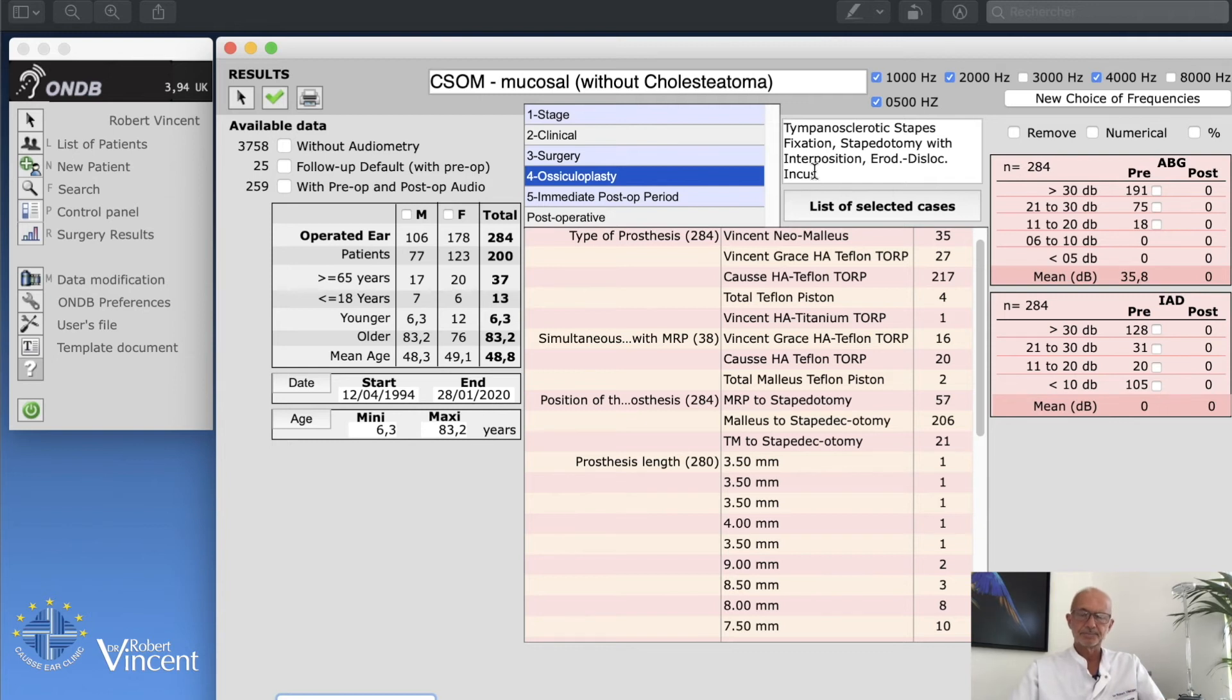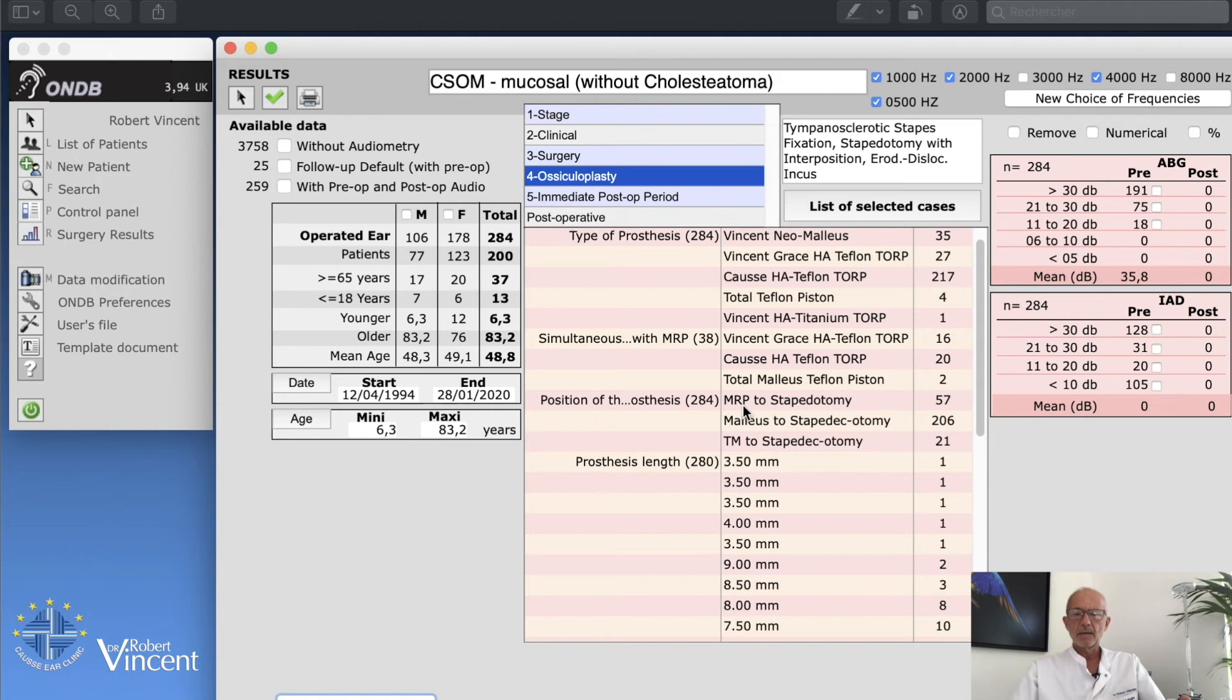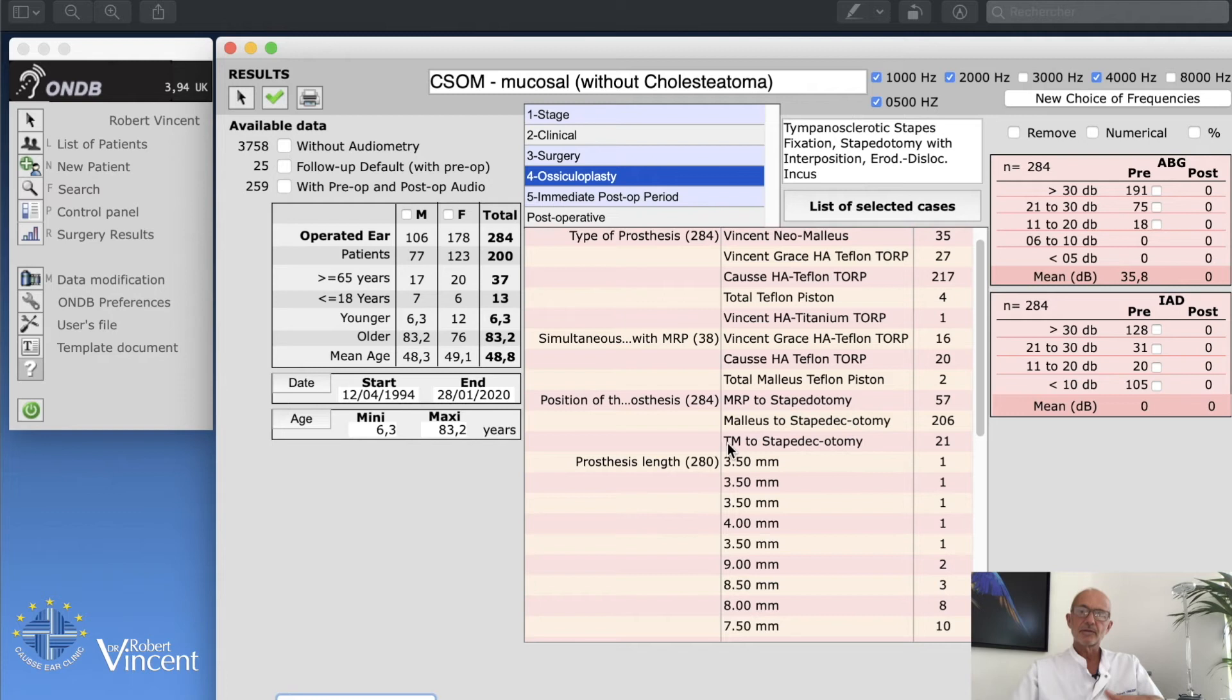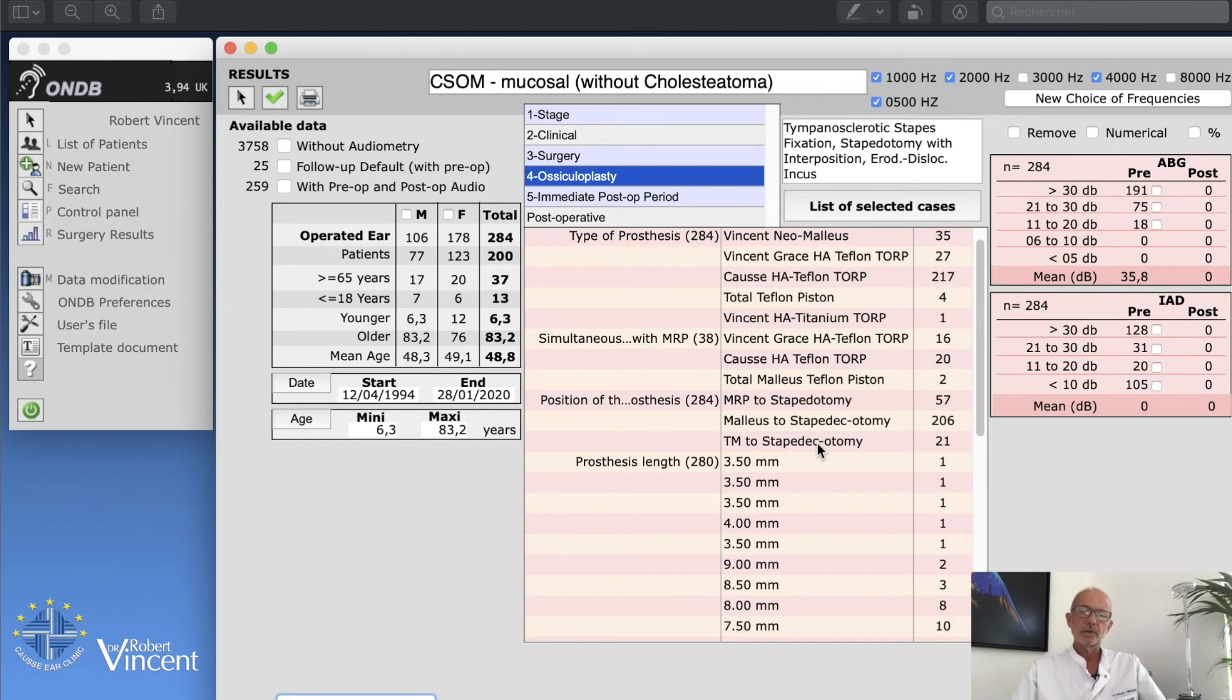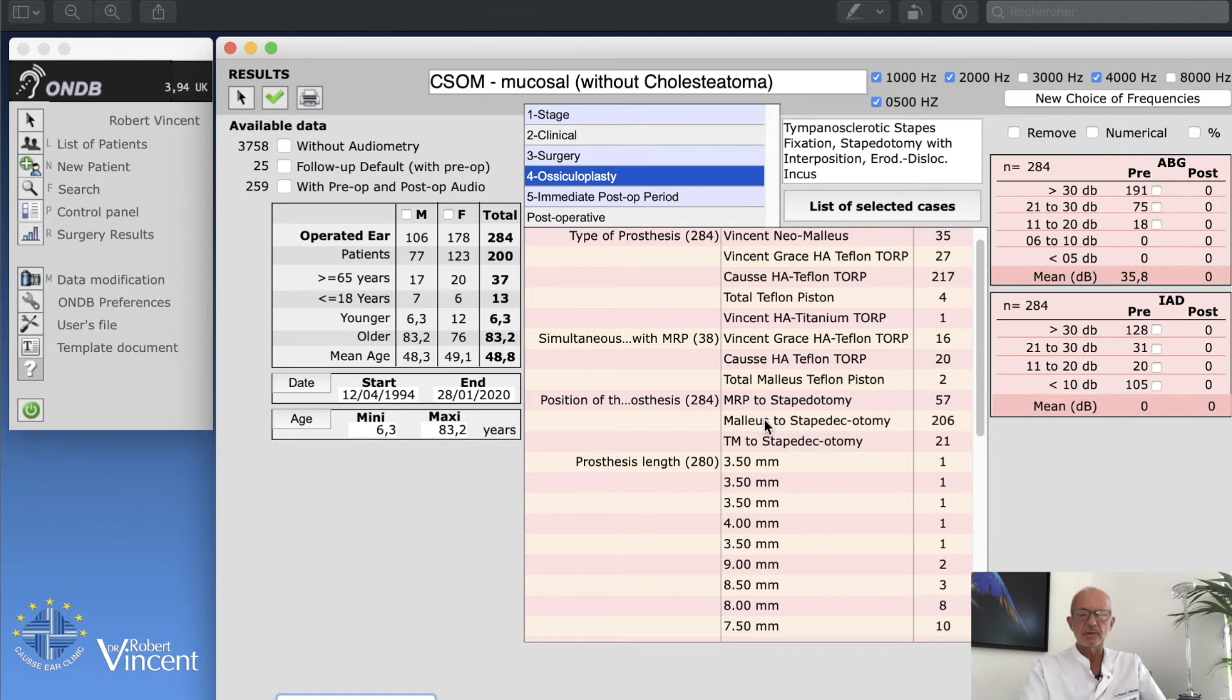Of course I had to use the TORP in any cases. If you go to position of the prosthesis, we have MRP malleus replacement prosthesis to stapedotomy, we have malleus to stapedotomy, and we also have tympanic membrane to stapedotomy, which is of course not the same. We all know that the result would not be the same if we put the prosthesis directly from the tympanic membrane to stapedotomy compared to the one from malleus. There's a better chance.